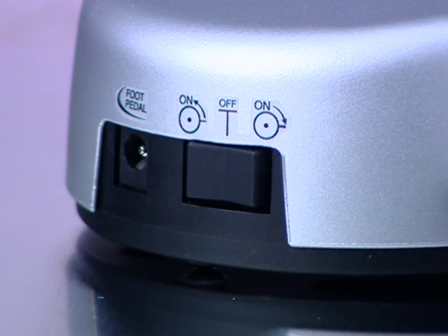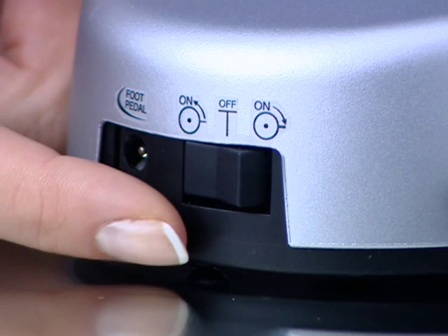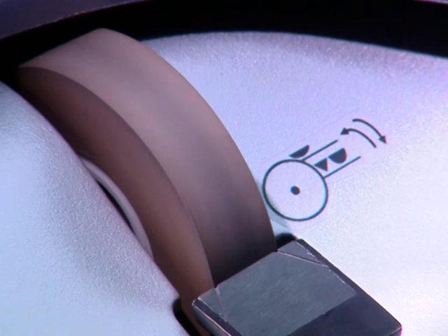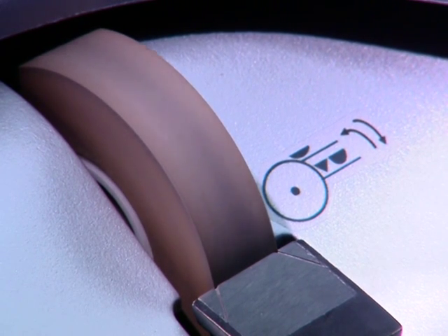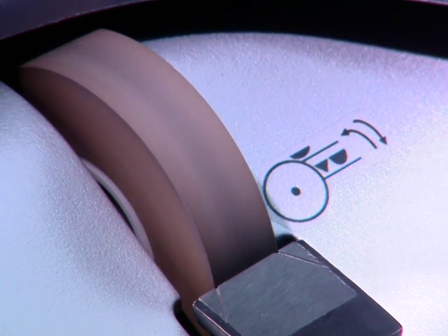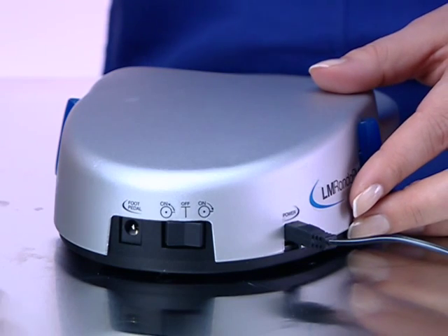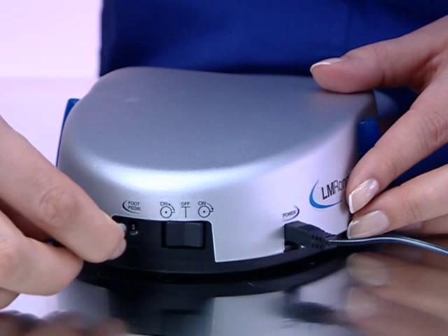The power switch is found on the side of the machine. This switch also controls the direction of stone rotation. When the sharpening stone is rotating toward the instrument, the grinding effect is more powerful. When rotating away from the instrument, the effect is gentler. A foot pedal can also be connected to the Rondo Plus.